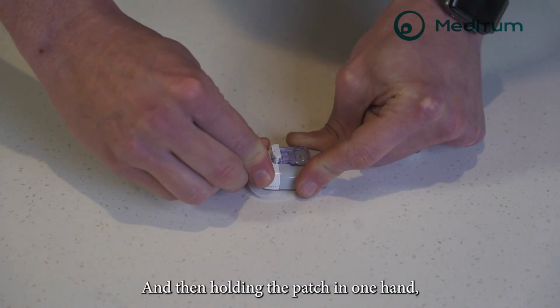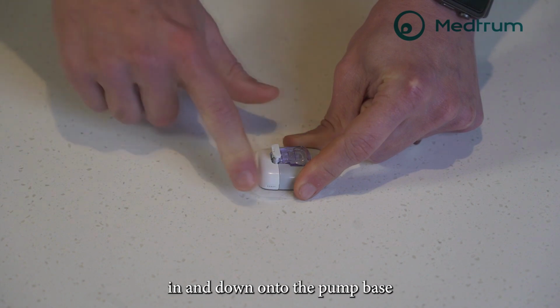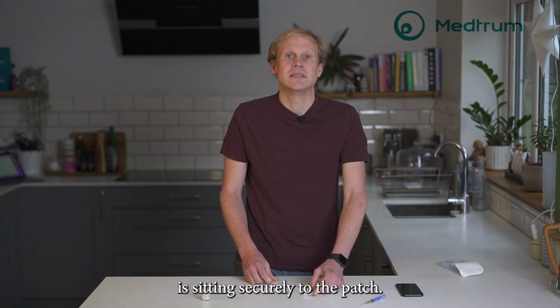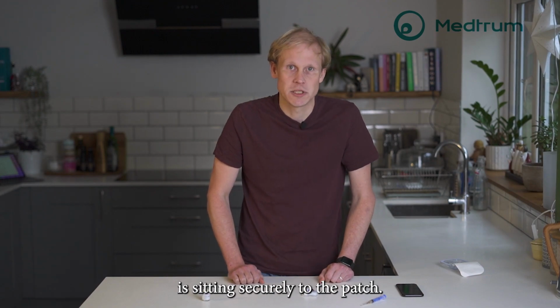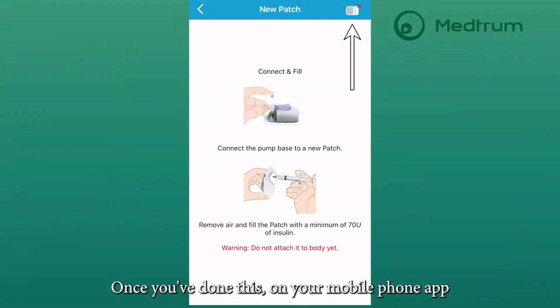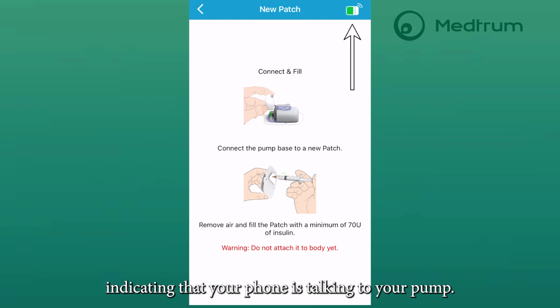And then holding the patch in one hand, we push at a 45-degree angle in and down onto the pump base to make sure the pump base is sitting securely to the patch. Once you've done this, on your mobile phone app, your pump icon in the top right hand corner will have turned green, indicating that your phone is talking to your pump.